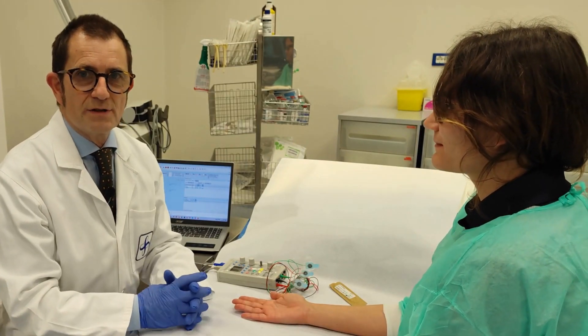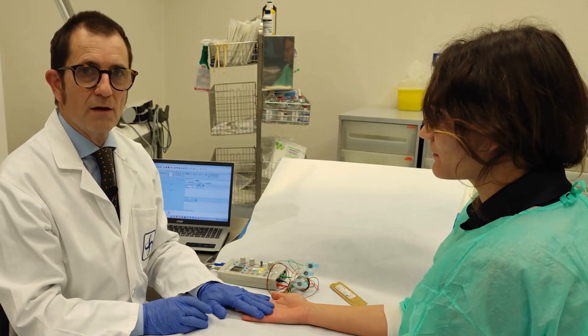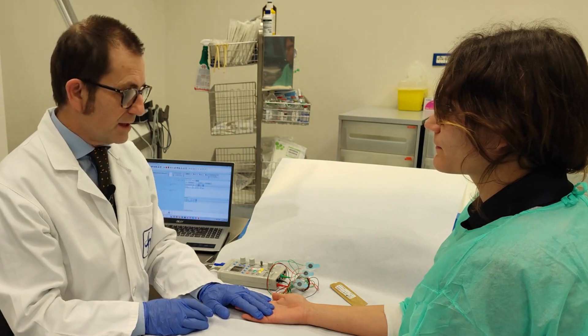Good morning. Today I would like to present you the correct positioning of the electrodes on the skin for a motor conduction study.